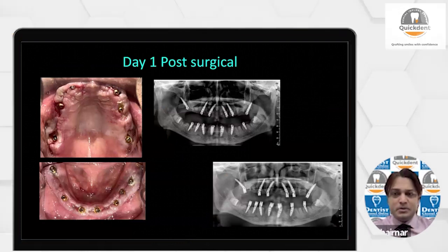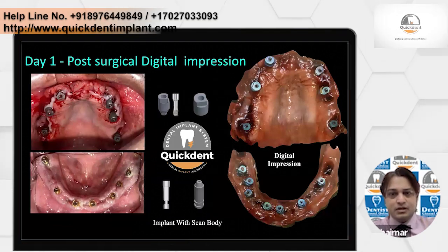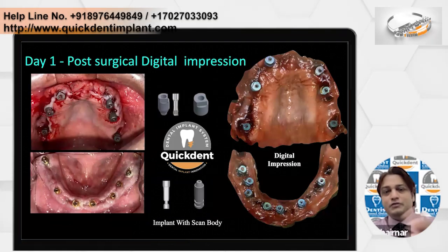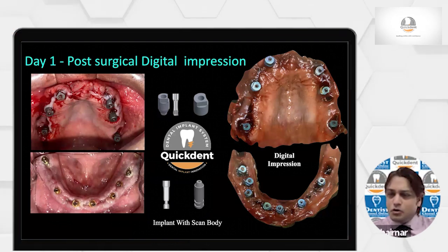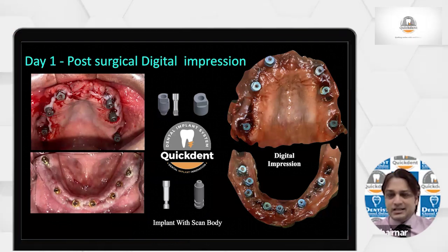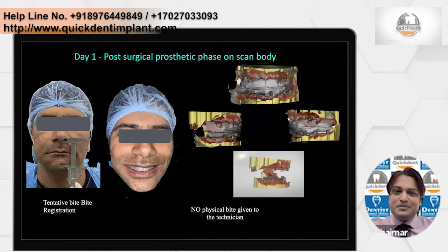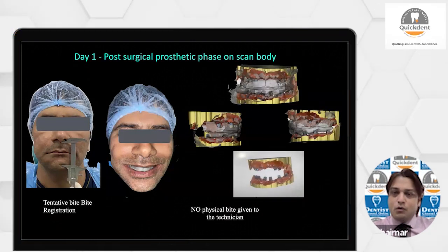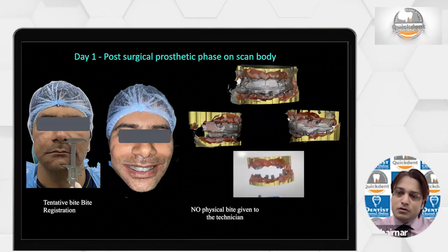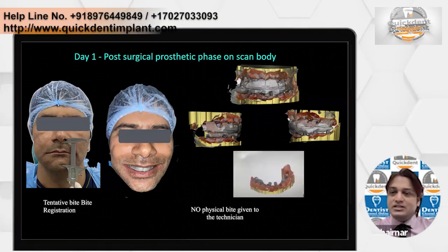All these are the TPR implants from QuickDent. We attach the QuickDent scan body, that is the multi-unit level scan body. They also have an implant level scan body, but when you're using multi-unit, you have to use the multi-unit scan body, upper and lower jaw precisely. Okay, and at the same time take the bite. So now how do we take the bite? We take the bite on the multi-unit scan body itself. Okay, and then we recheck it, we scan the bite.